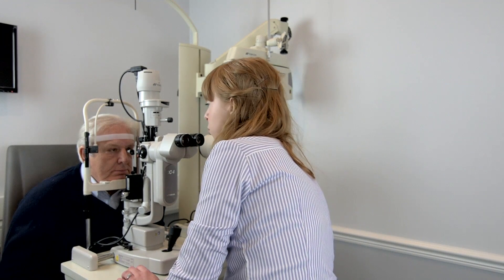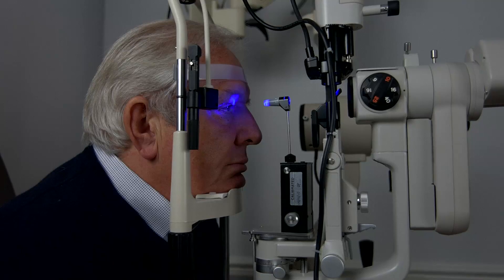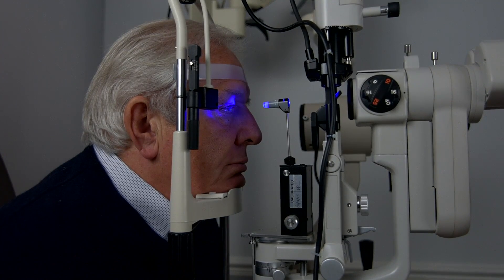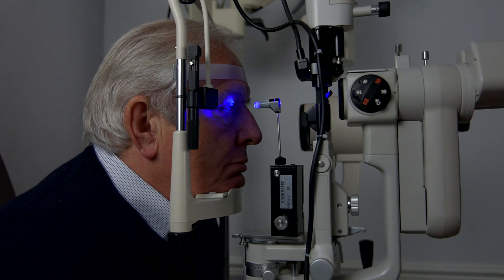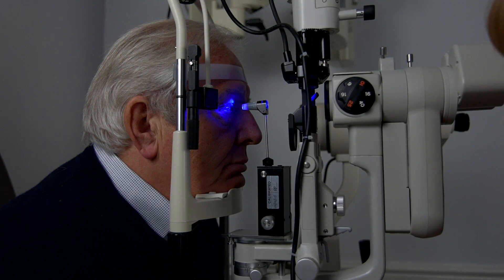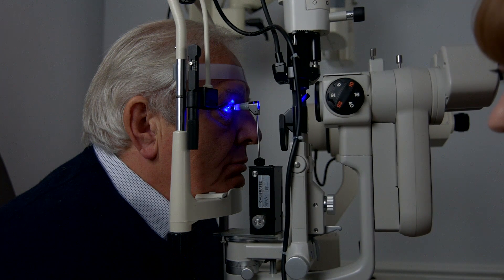Now I'm just going to turn off the room lights. So if you just look straight past my shoulder. And if you take a couple of blinks, and then keep on staring straight ahead.